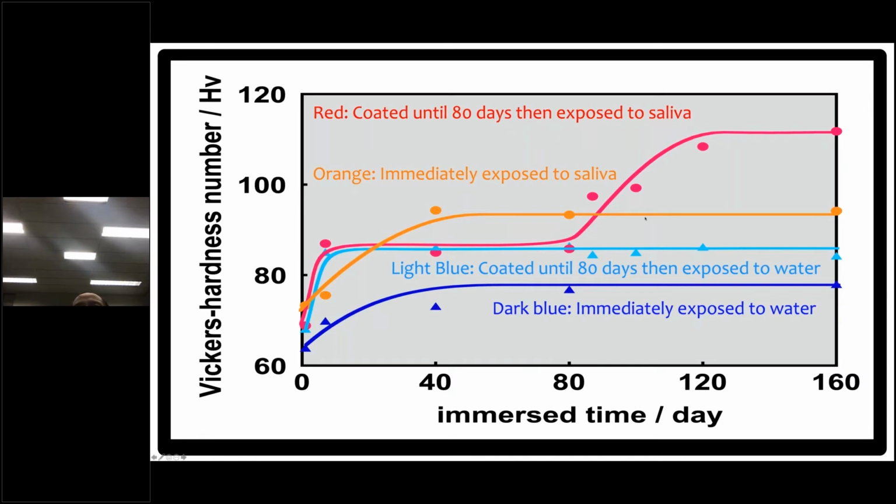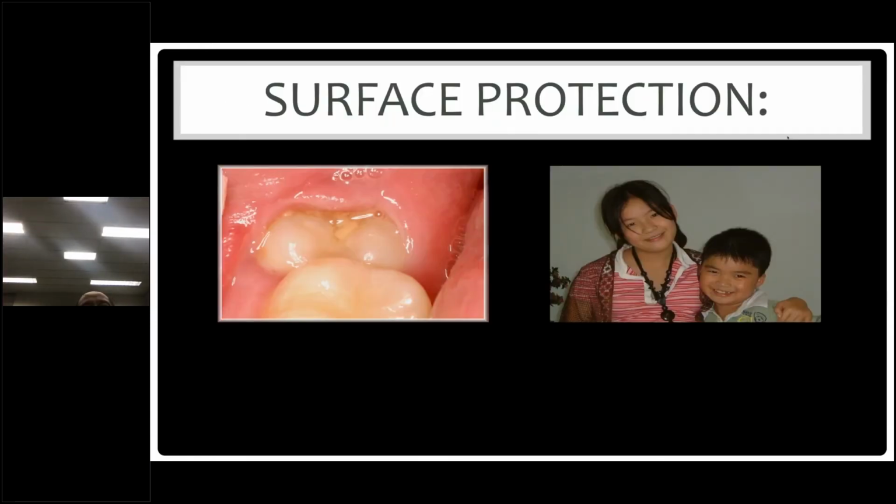You can believe that with a healthy saliva, that glass ionomer cement becomes even harder. So I will tackle that a little bit later on. I will step back now and talk of a new concept on how to use Fuji Triage Pink.